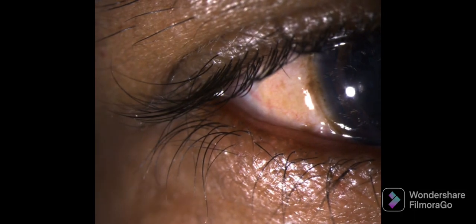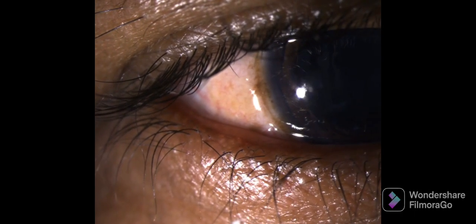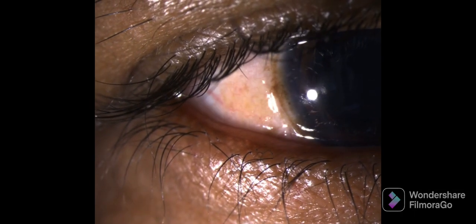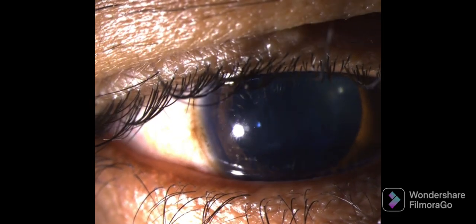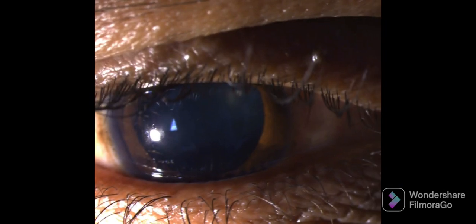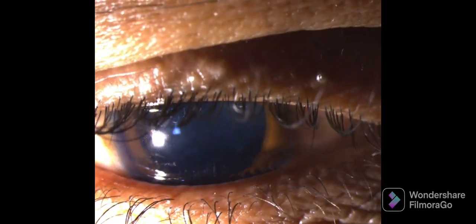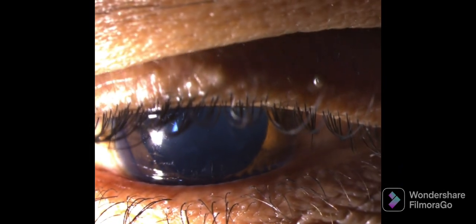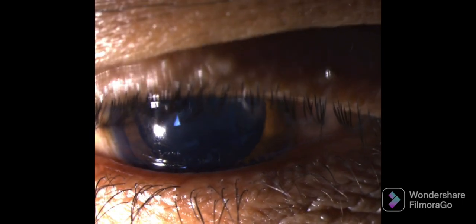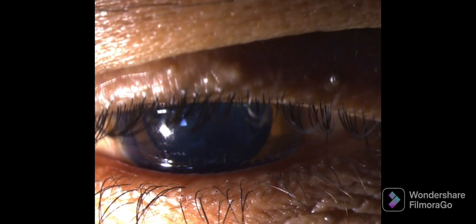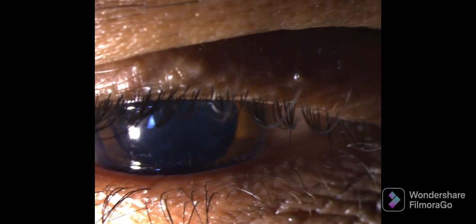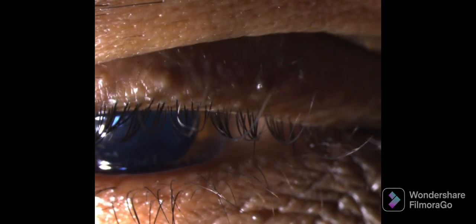The third structure to be examined is the upper eyelashes, which are examined for their color, direction, and the presence of any extra rows of eyelashes. This is the normal appearance of eyelashes in our subject.